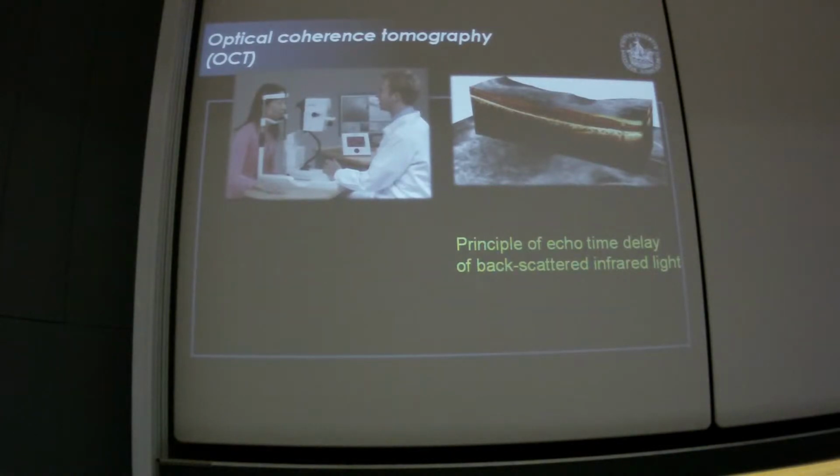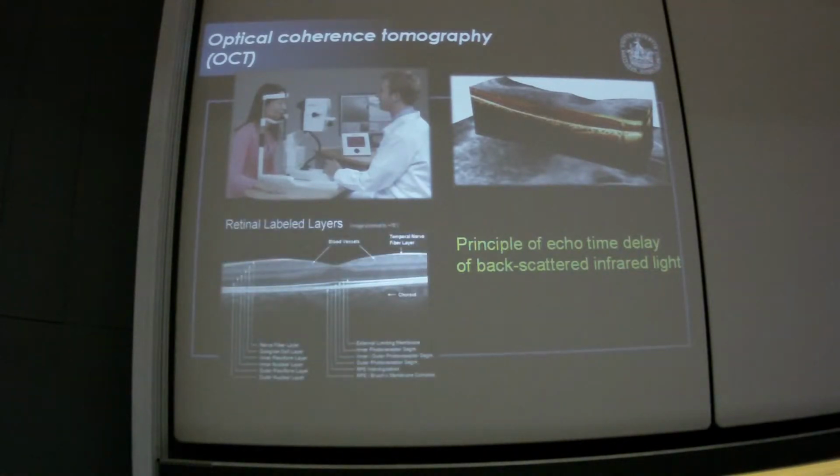What you do in optical coherence tomography is that we basically apply laser light to the different retinal layers, and the laser light then gets reflected, and from the runtime differences or runtime delays and from spectral shifts that occur in this process, you can more or less reconstruct nice 3D images of retinal structures, but you can also use this to do some kind of thickness measurements of the different retinal cell layers.